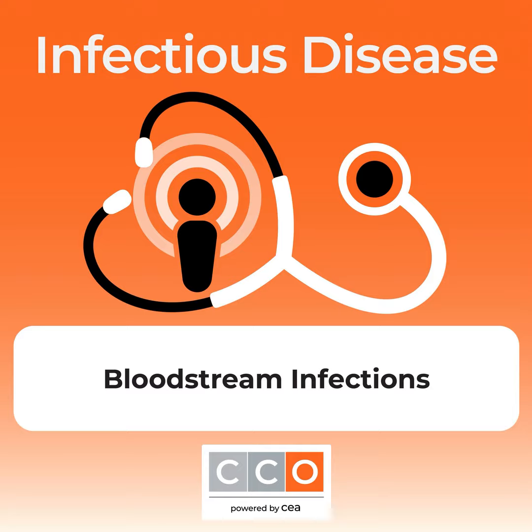We want 2 sets of blood cultures for an adult patient. That's actually 4 of those hot sauce bottles, 1 aerobic and 1 anaerobic per set. And each needs to be filled with 10 milliliters of blood. So that's 40 mLs of blood for 2 good sets of blood cultures. These bottles are often inappropriately filled, most often underfilled, and up to 40% of blood cultures are sent as 1 set instead of the recommended 2 sets.